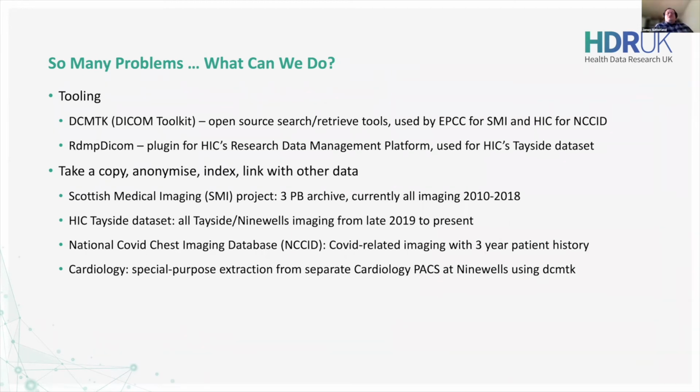So I've gone through a lot of interesting technical and non-technical challenges that you face trying to use real PACS data. There are various tools you can use to help address these. There's the DICOM toolkit, which we've been using, and in particular within HIC for the NCCID project, we've pulled around 25 terabytes of chest imaging data now for that database I mentioned earlier.